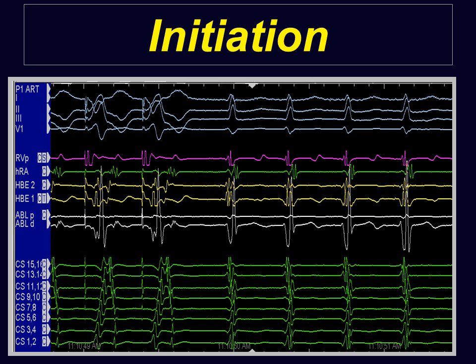So this, you can also initiate tachycardia while doing ventricular extra stimulus. And here it is going through the fast pathway because the earliest is his A. And then you have a long AH interval. Typically about 200 milliseconds is the slow pathway part, and the fast pathway occupies a negligible portion. So that's why about 220 or so antegrade, and about turnaround and all that may take about 320 to 380 milliseconds is the usual cycle length.